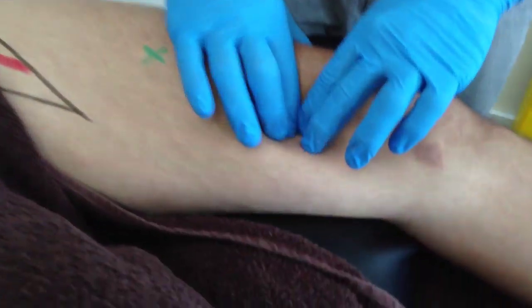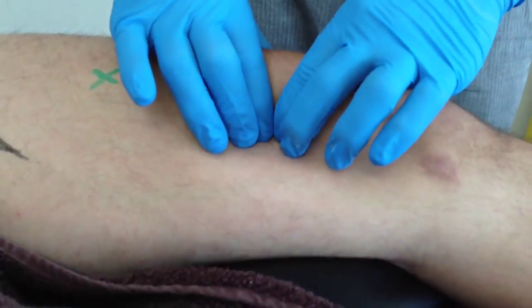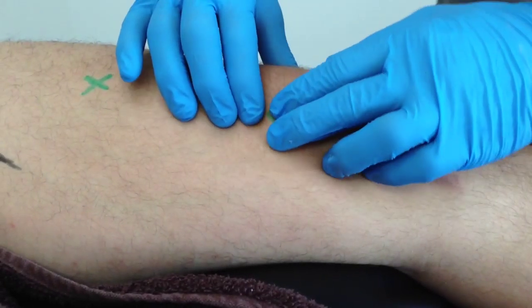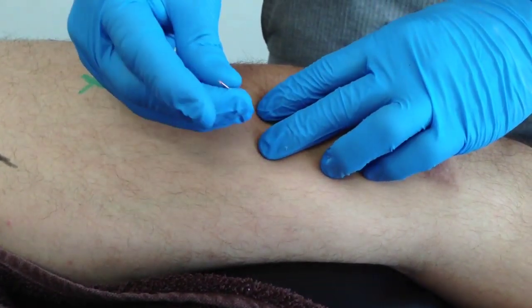The inferior trigger point one should be located in the centre of the lower part of the muscle belly. The needle can be inserted at a 90 degree angle into the trigger point taut band.